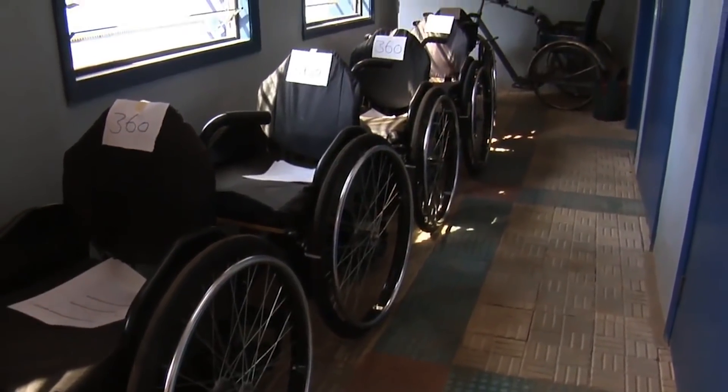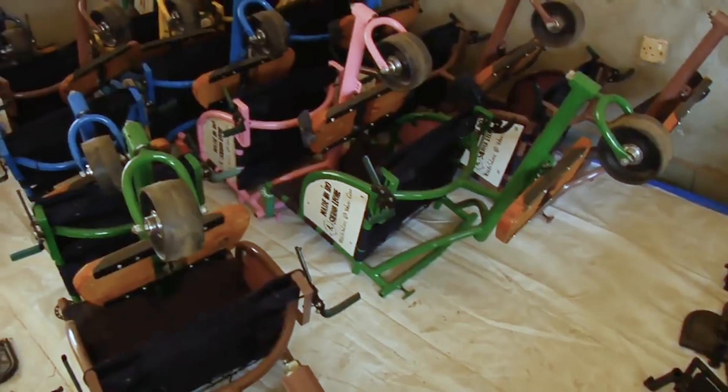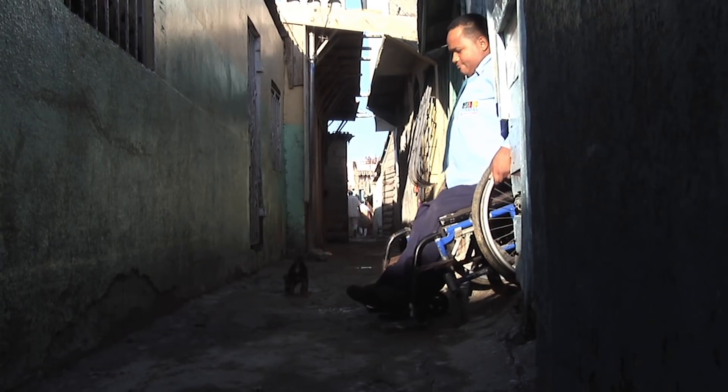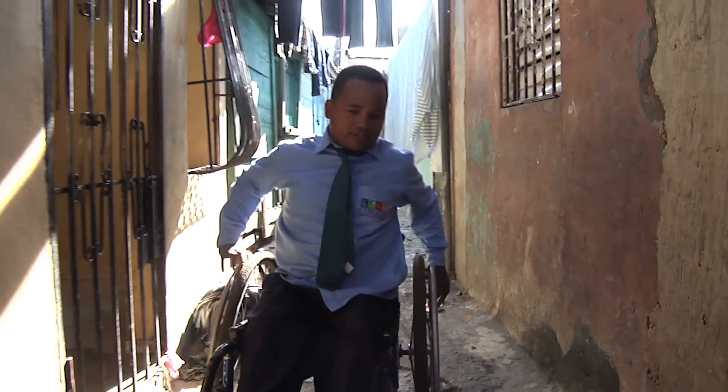LDS Charities has five different sizes of wheelchairs that they are making and distributing around the world. There are a lot of people who need a wheelchair but also need to cover longer distances, which is much more difficult physically in a standard wheelchair. A hand trike enables them to go a longer distance with less effort.